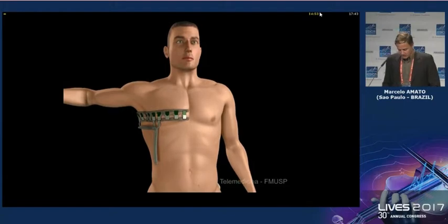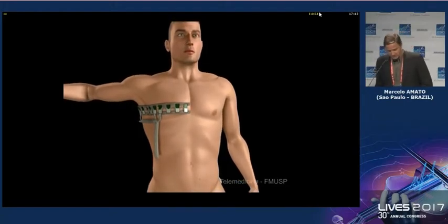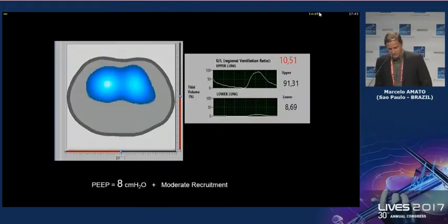So we are also going to talk about EIT, but focusing on perfusion. Just a brief comment after the talk of Belani. We have recently finished this protocol in which we assessed EIT distribution of ventilation in patients with acute respiratory failure after cardiac surgery.